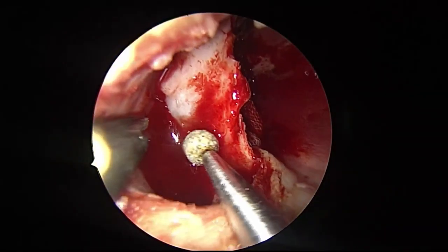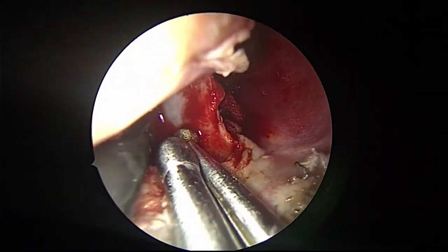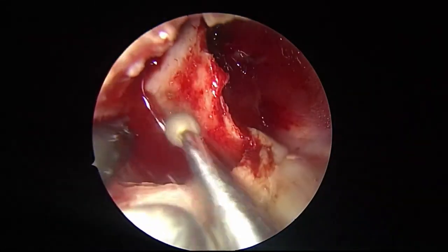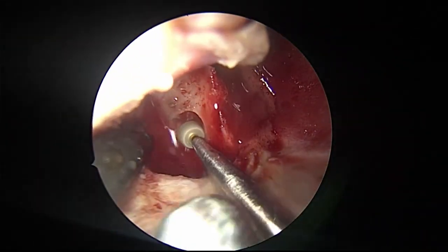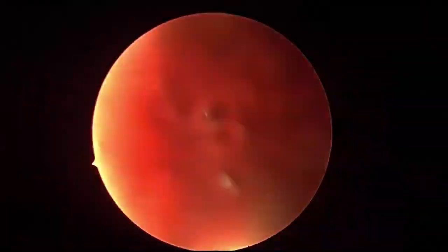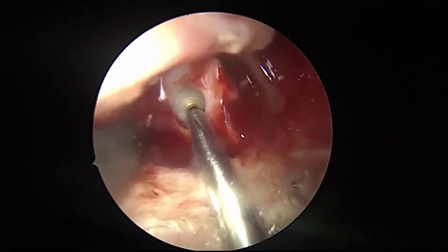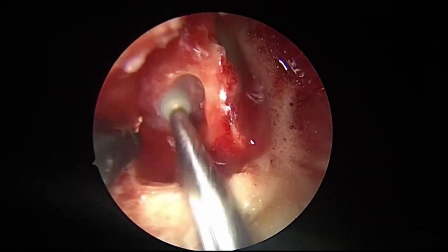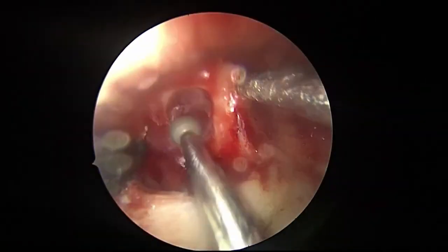Okay. This is my Medtronic high-speed drill. See, this is a 15-degree coarse diamond bur. Entering head on into the maxillary sinus. See this? We'll show you the level of the roof. Till then, we have to remove the bone. I could have done this with the chisel and hammer as well.